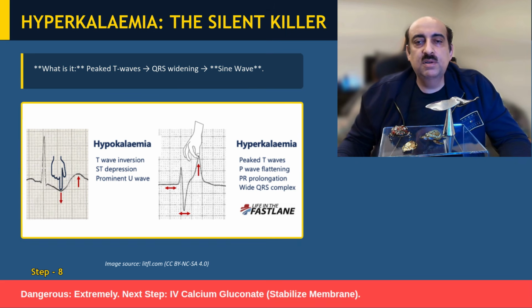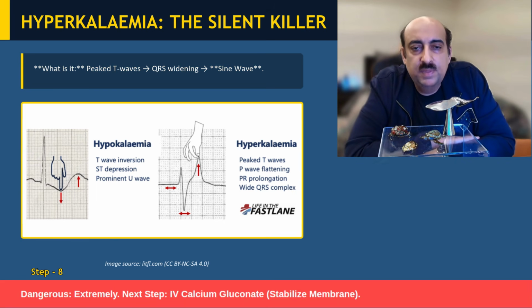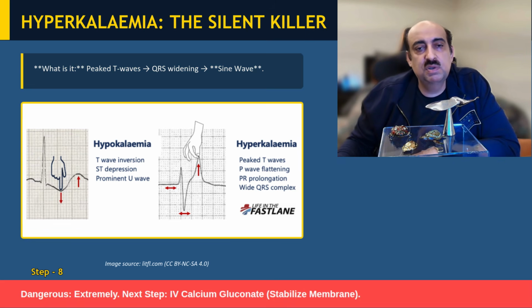The two main pathologies or problems with T-waves can be acute tall tented T-waves, indicative of hyperkalemia. If it becomes severe, it can eventually lead to flattening of the P wave, PR prolongation, and subsequent widening of the QRS complexes. So these are the sequential changes.